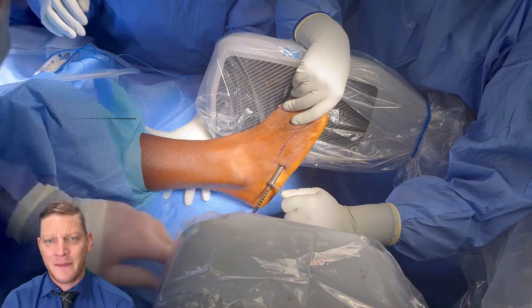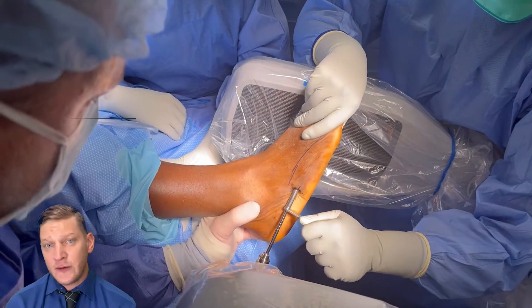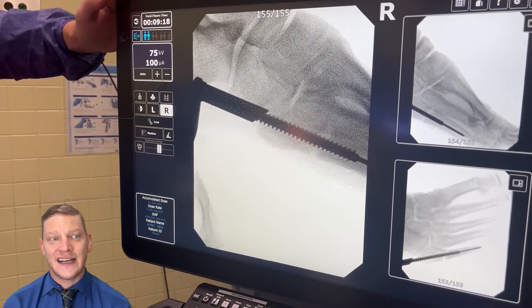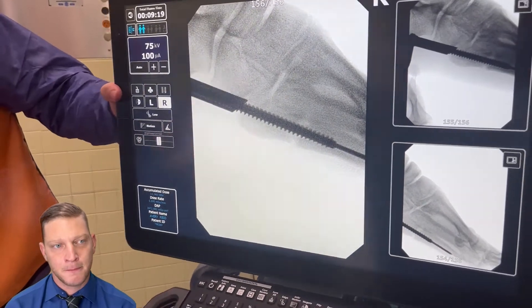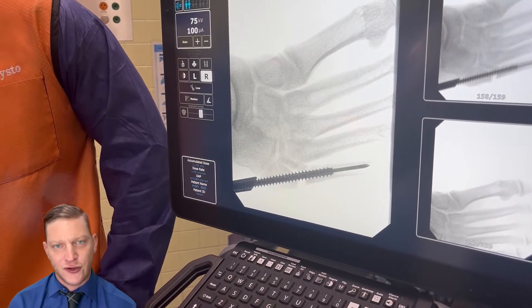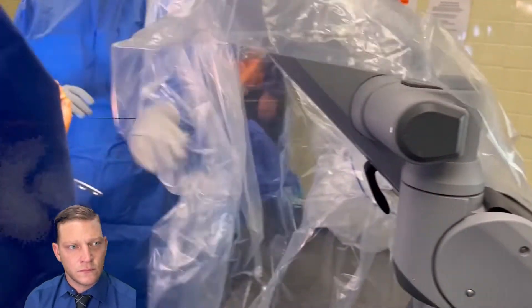Here it looks like I got it on the first try — hopefully my editor makes it look that way — but I assure you I did not, and that's not abnormal. I've been in the OR with very experienced orthopedic surgeons, foot and ankle fellowship-trained from the Hospital for Special Surgery, and they don't get it on the first try either. I'm heading a little too lateral here — it'll pop out the lateral cortex. I don't want to make Swiss cheese out of his cortex, so I back up and retry. Some extra fenestration in the fracture zone is okay and actually encourages blood flow.